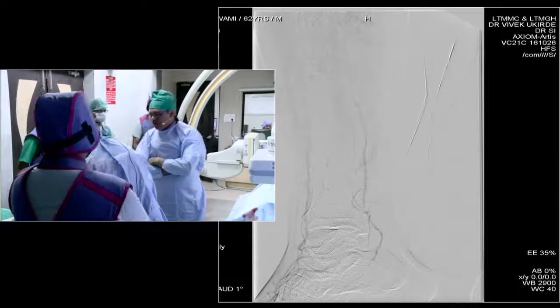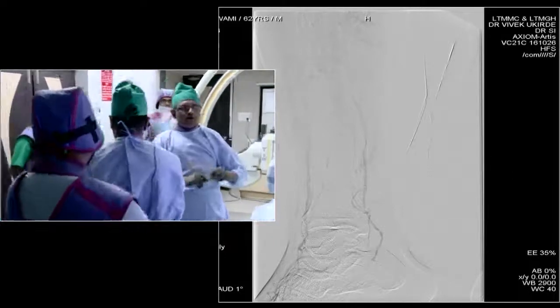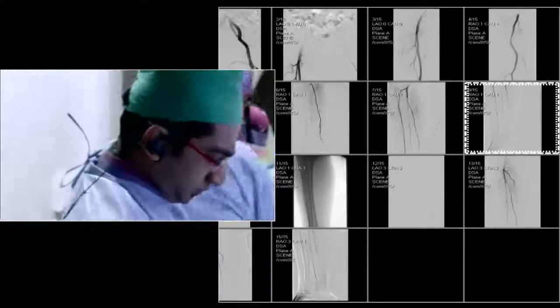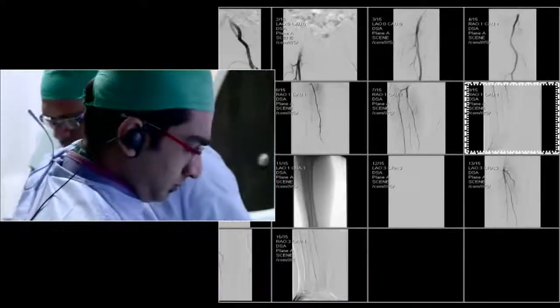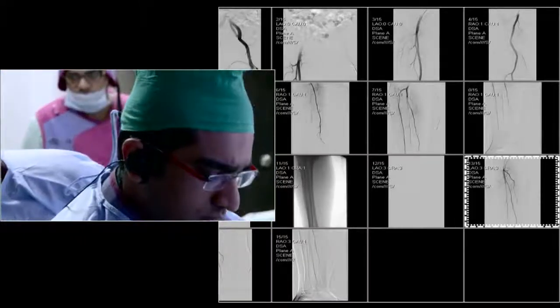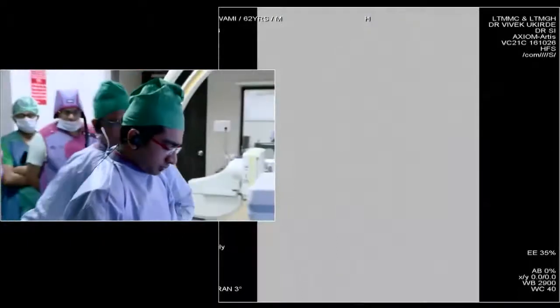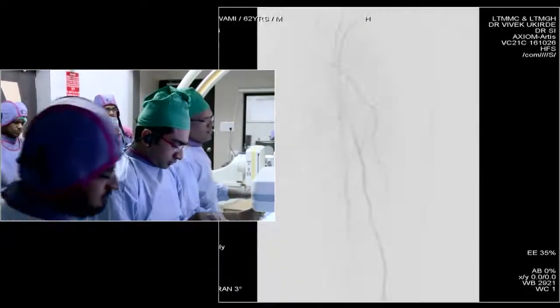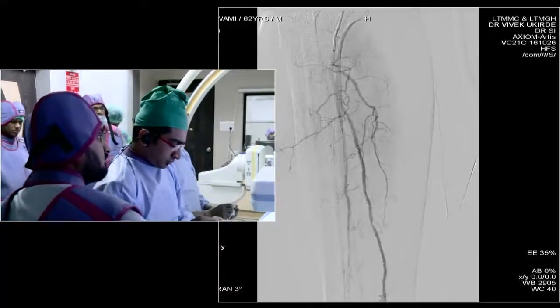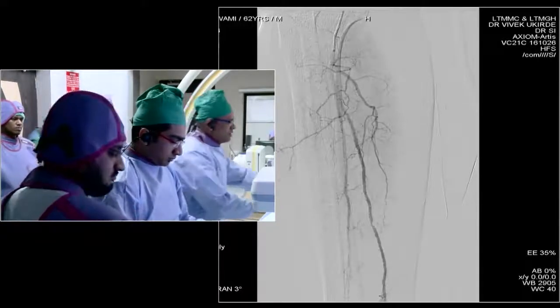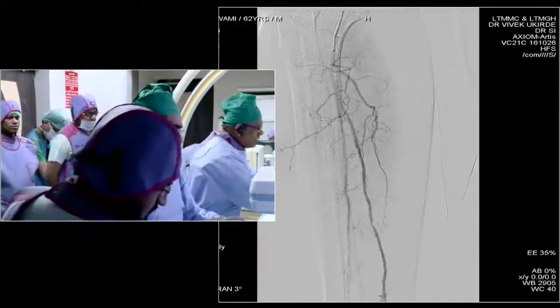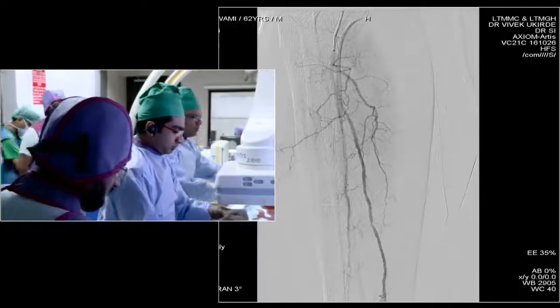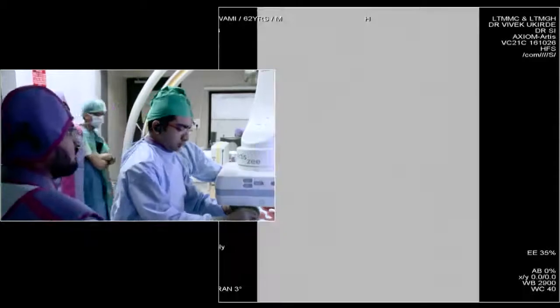In this case, as you can see, the anterior tibial artery — the dorsalis pedis — is occluded. So your chance of saving the foot is only if you open up the posterior tibial artery. We are loading the balloon now.